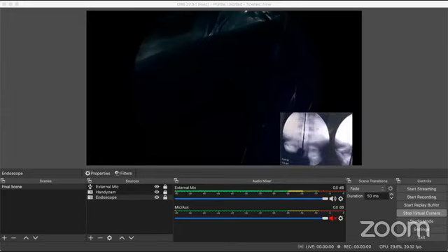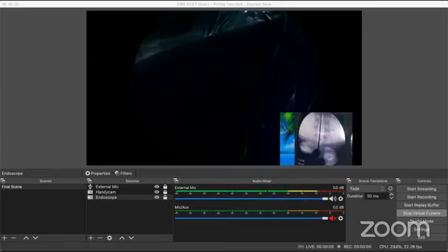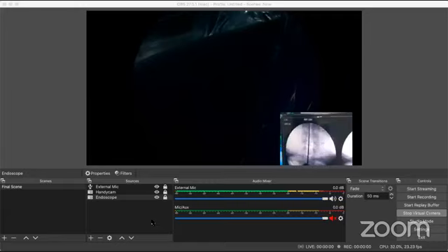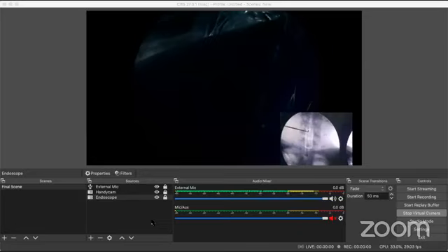I'm marking the midline. After I mark the midline, I want to mark the level of the disc, that is the C5, C6 disc. Where I see the first rib, that is T1. The one above that is C7, then C6 and C5. So I'm going to go on the C5, C6 disc, and I'm going to put a marker there. Shoot, please. I'm a little low. I'll just correct myself. Shoot, please. Yes, this is the C5, C6 disc. Can you see it?